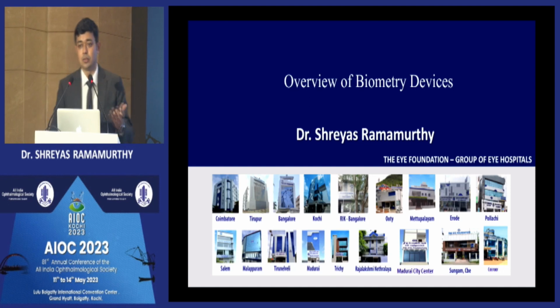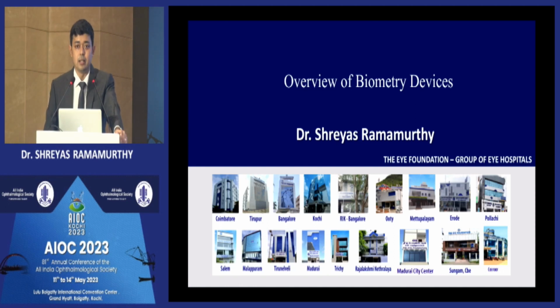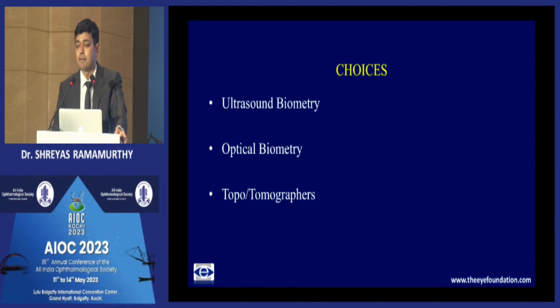So I will be taking you all through an overview of the biometry devices. And like sir was saying, today the combination of biometry devices and advanced biometric formulas is what is really making cataract surgery into a refractive cataract surgery. And truly, we have a variety of choices today. And as we speak, more and more devices are getting included into the market. So I'll try to present an overview, try to give some of the concepts, while I will not be able to cover the entire gamut of devices. So we have ultrasound biometry, optical biometry, and topo and tomographers, OCT based biometers as well.